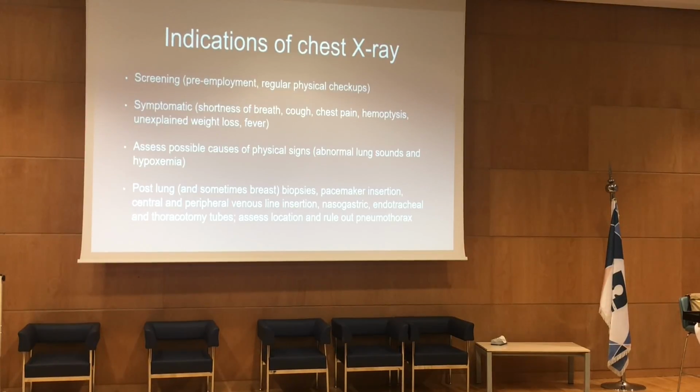Inpatients and ICU patients are, some of the time, agitated, they might pull on their tubes, their nasogastric tube, their lines, so you have to make sure, every day, that these are in the adequate location. You have to make sure that the patient did not develop any new effusion, which is fluid in the lung, or atelectasis, which is lung collapse. So you want something that is the lowest dose of radiation you can get, which is the chest x-ray, just to follow up what you already know by CT.